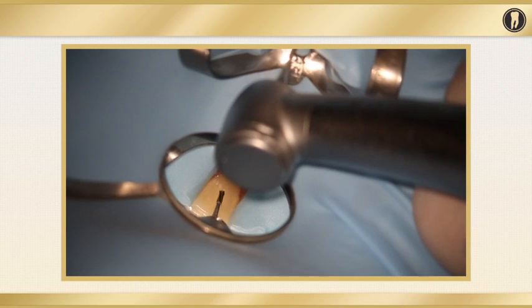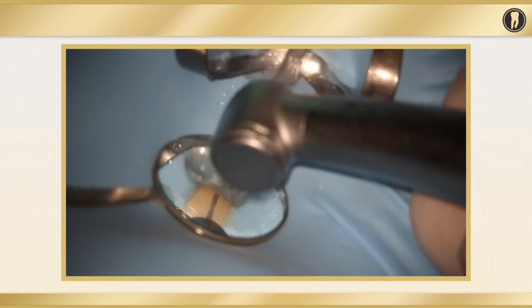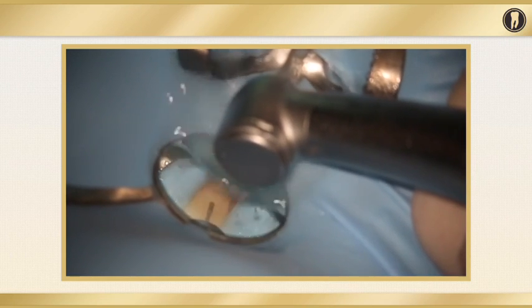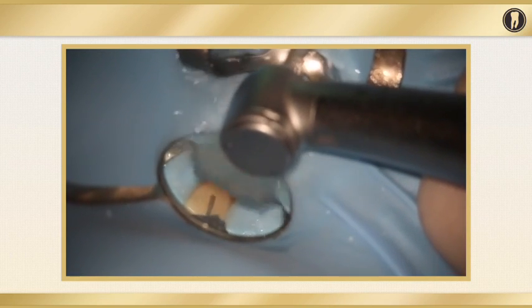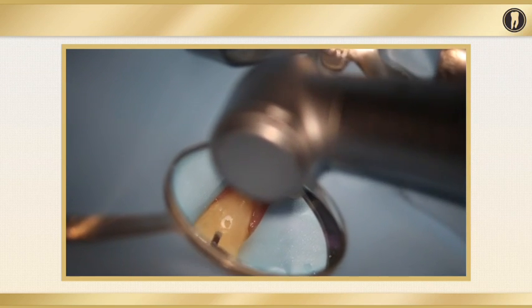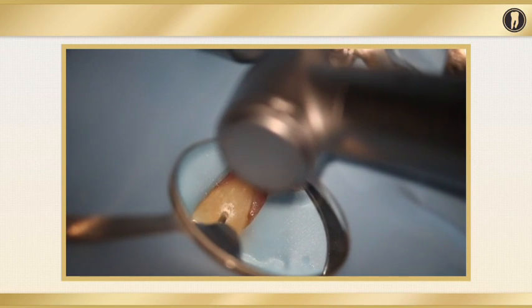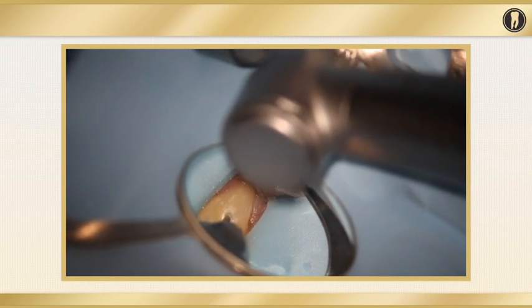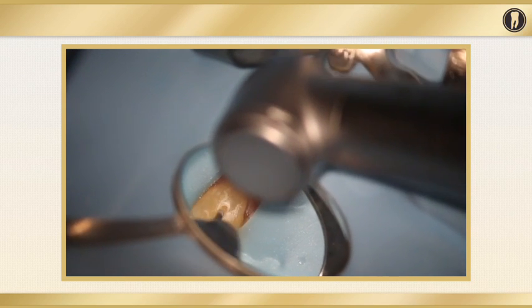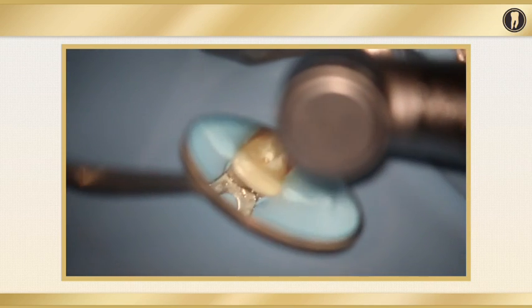Here's a lower anterior access video where I'm accessing tooth number 25. These cases can be very difficult to access. Not very difficult, but somewhat difficult because they have such a narrow mesial to distal width. So you have to be really careful when you access these teeth. I will start with a 330 long carbide burr or a number 2 diamond round burr. And I'll just go slow. I think the key here is small bites. You're taking your time. Take 5 minutes or so to get into this pulp chamber.